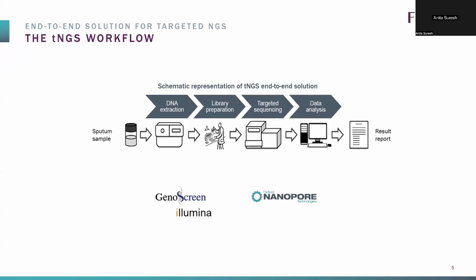This includes the extraction, the library preparation, the targeted sequencing itself, the data analysis, and then the report. At that time, a few companies came forward. The data I'll be presenting today is for two of those that completed their review on time and submitted the evidence to the WHO.